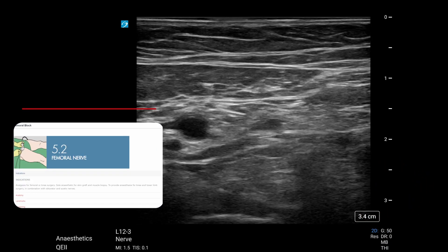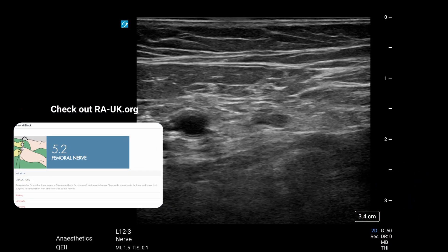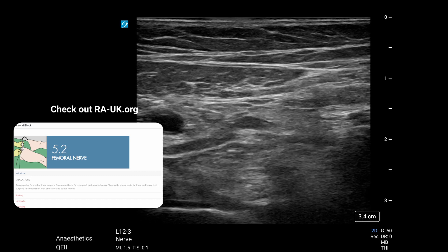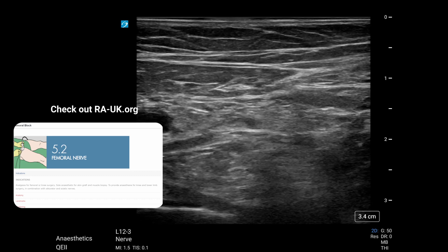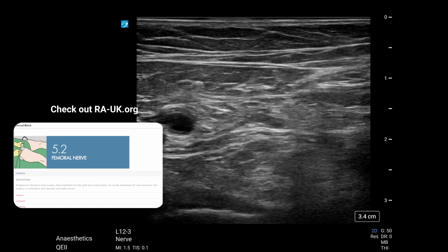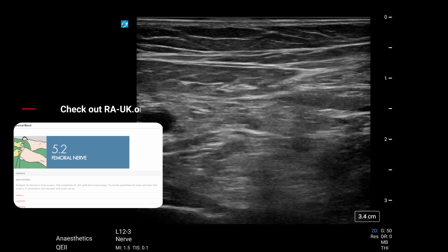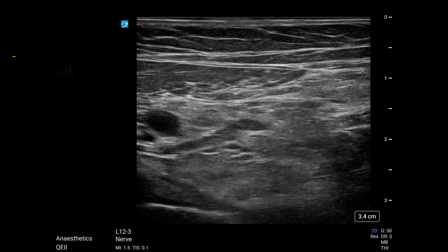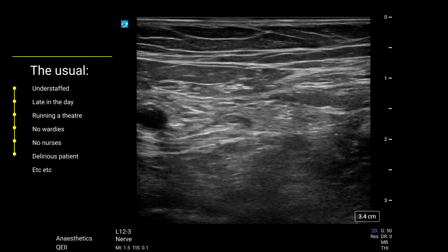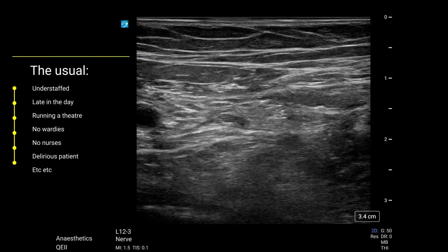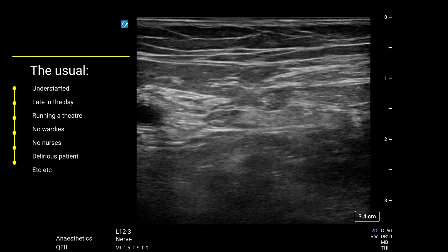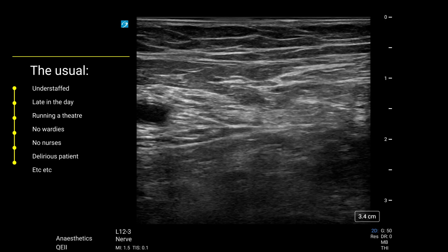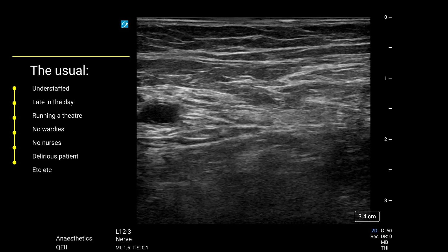We're often guilty of only showing our good blocks where everything looks textbook. Femoral nerve blocks are plan A blocks — they're excellent for providing analgesia to the lower limb, and they're excellent at punishing overconfidence. This was a difficult patient at the end of the day with limited resources and time, as well as a few other excuses.